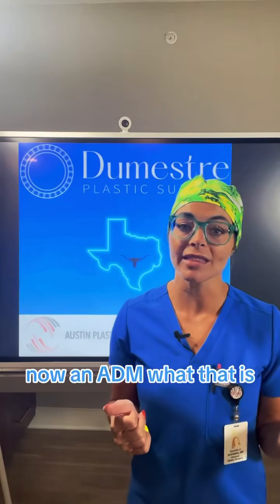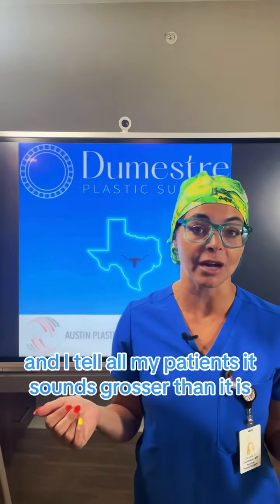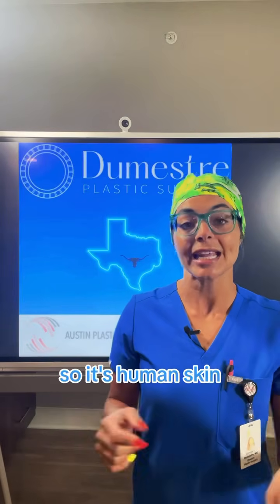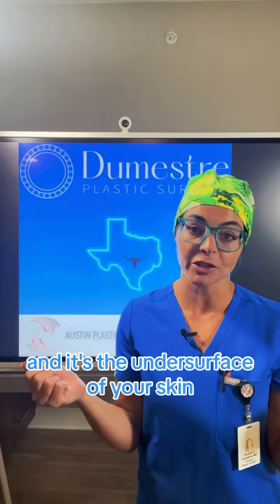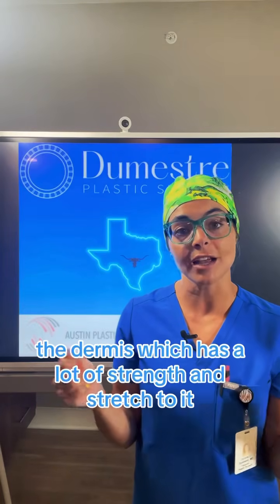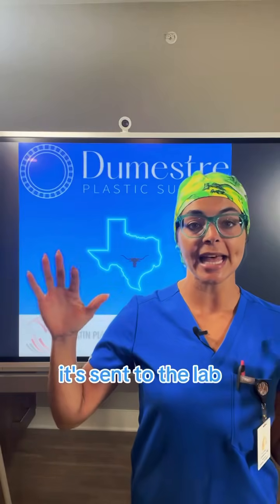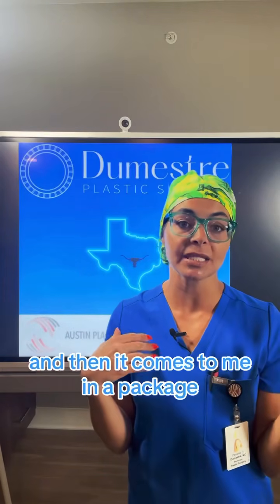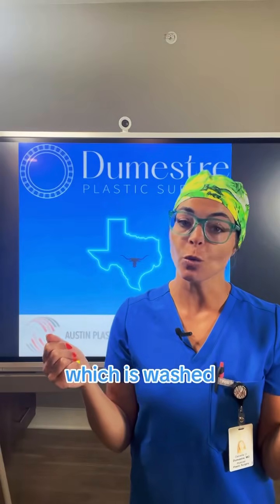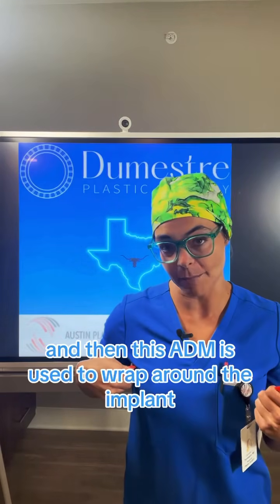Now ADM, what that is, it's an acellular dermal matrix, and I tell all my patients it sounds grosser than it is. So it's human skin, and it's the undersurface of your skin, the dermis, which has a lot of strength and stretch to it. So it's harvested, it's sent to the lab, they process it, they remove the human cellular component, and then it comes to me in a package, which is washed, and then this ADM is used to wrap around the implant.